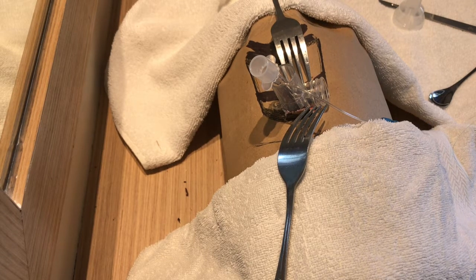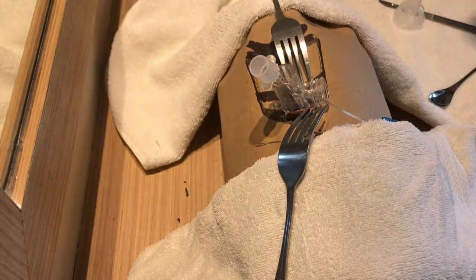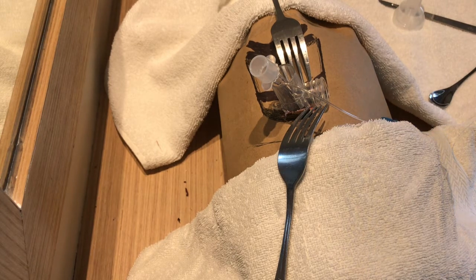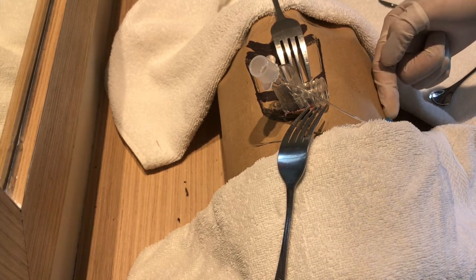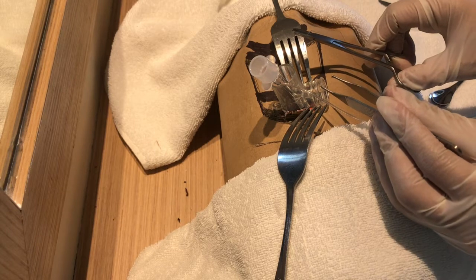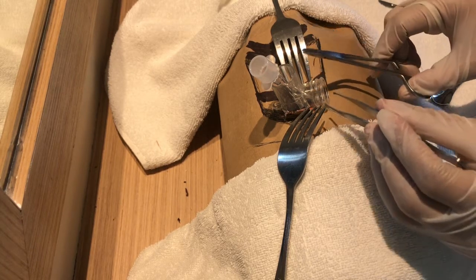Thread tapes should be attached through the holes in the flanges of the tracheostomy tube and passed around the neck. Tie them with the neck flexed. Then the ties should be tight enough to admit no more than a single finger under the tape. Then, suture the tracheostomy tube to the skin for the first few days until maturation of the tracheocutaneous tract.